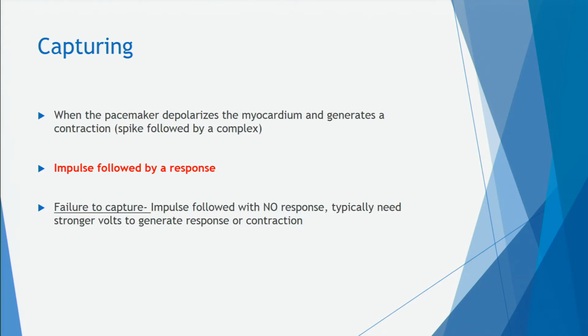So when you get ready to pace a patient, the most important thing is that you're going to connect your EKG leads because it needs a good EKG reading, and then you're going to connect your pads to your patient. The minute you hit pace, it starts to synchronize itself. It's smart. It wants to know exactly what's going on. So it said, okay, we're going to do 60 beats. You know, we're at 40. We at least want to get to 60, right? A lot of times they'll say, let's pace it like 80. 60 is pretty low. And then all you're going to do is start to increase the current because we have to deliver the shock.